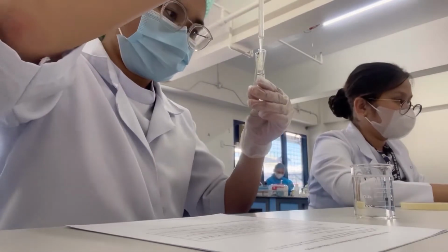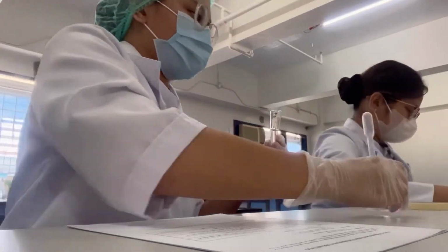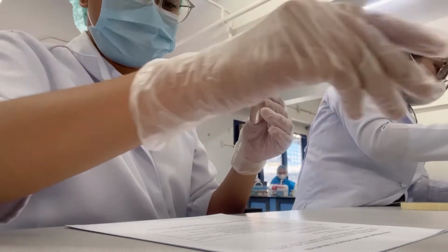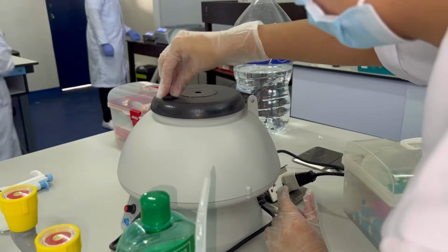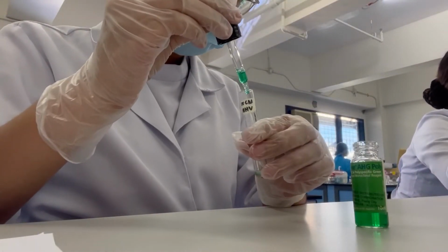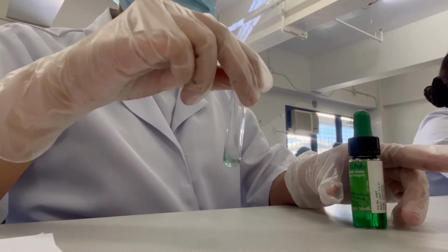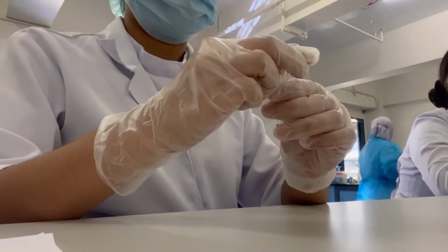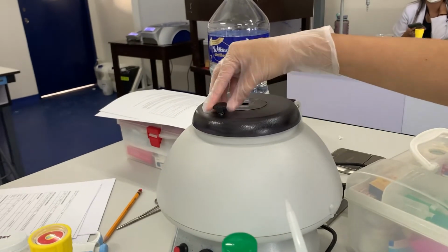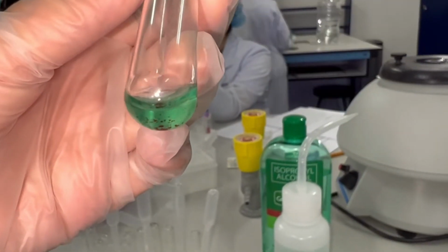Wash the red cells 3 times with saline and completely decant the final wash. After washing 3 times, add 2 drops of AHG to the dry red cell bottom and mix well. Centrifuge for 15 seconds at 3,400 rpm and observe for agglutination.